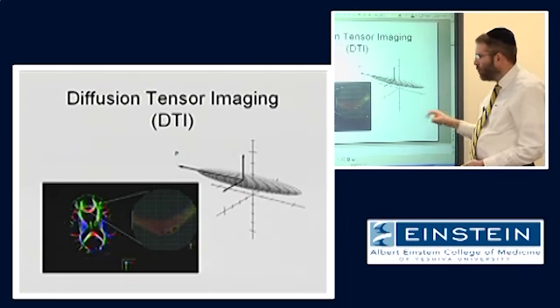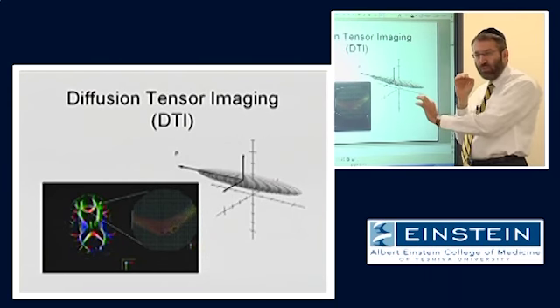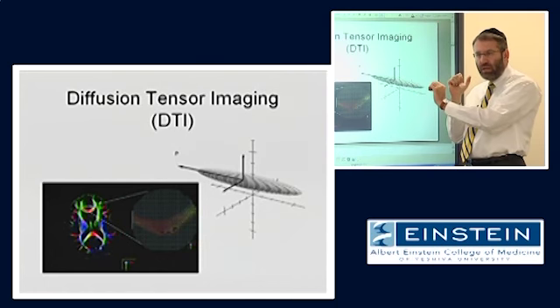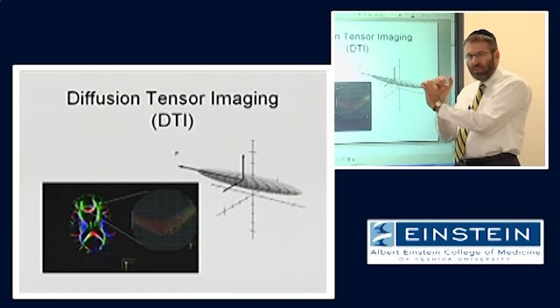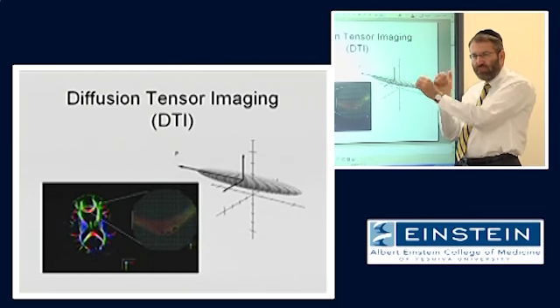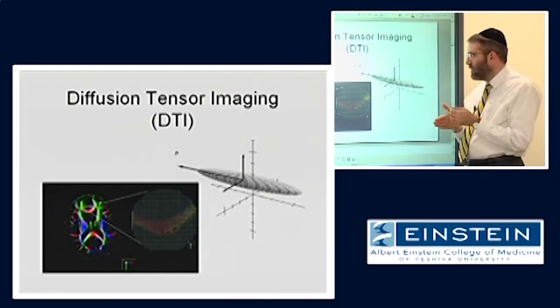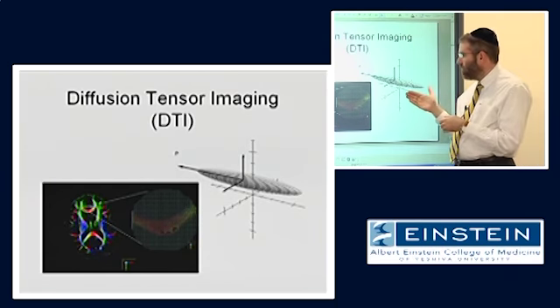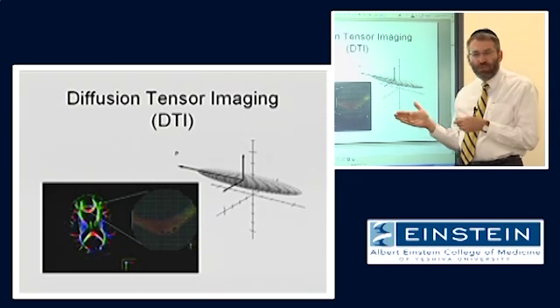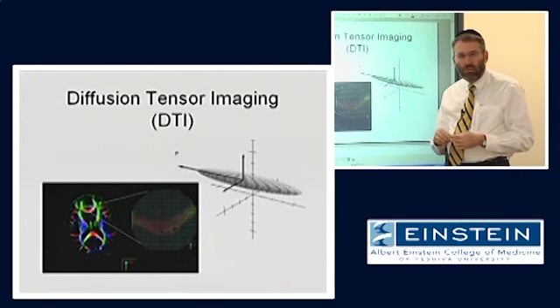In the corpus callosum, where diffusion is very uniform, where we have our most densely packed axons in the brain, this diffusion ellipsoid becomes extremely long and skinny because diffusion is almost all along that single direction. If we would look at the other extreme, use our same diffusion tensor approach to make a measurement from ventricular cerebrospinal fluid, what would it look like?